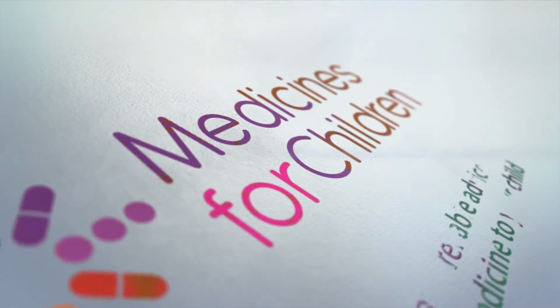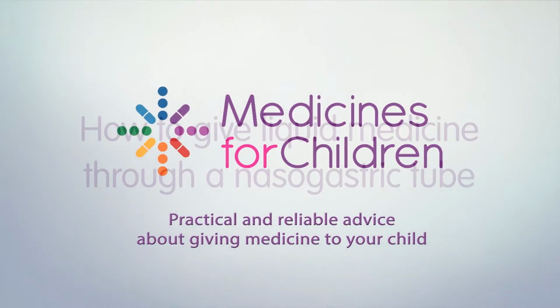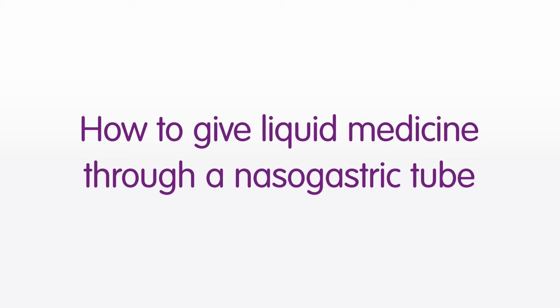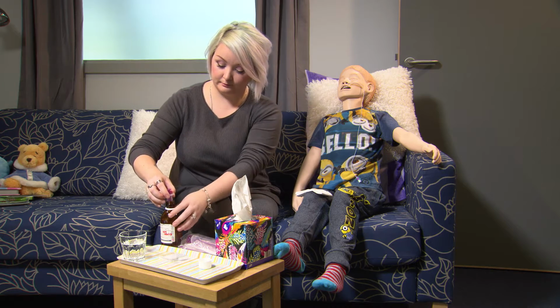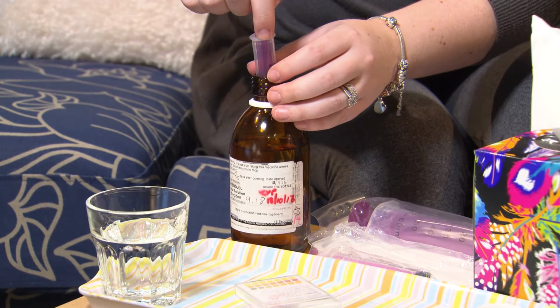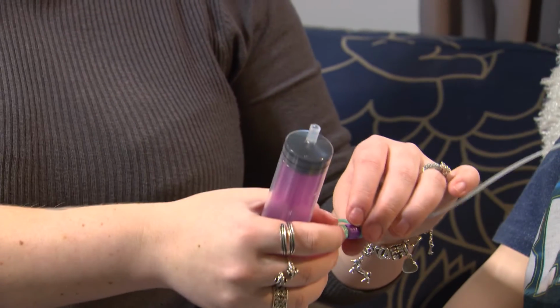Medicines for children. Practical and reliable advice about giving medicine to your child. How to give a liquid medicine through a nasogastric tube, NG tube. It is very important that you are happy and confident to give medicines to your child. This film will show you how to give a liquid medicine to your child through a nasogastric tube.